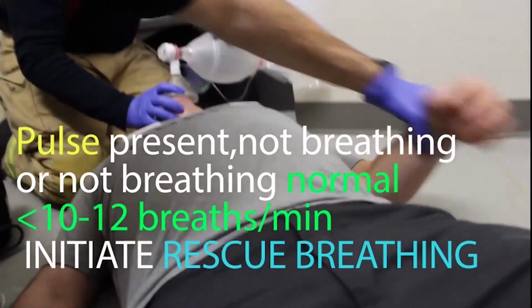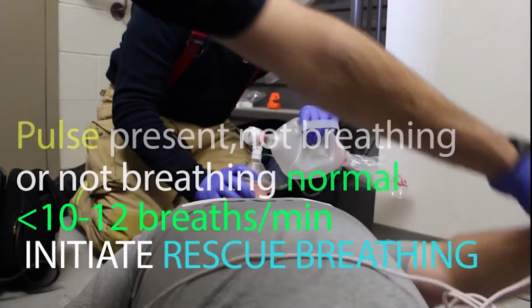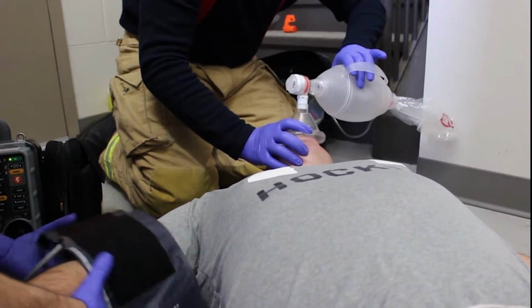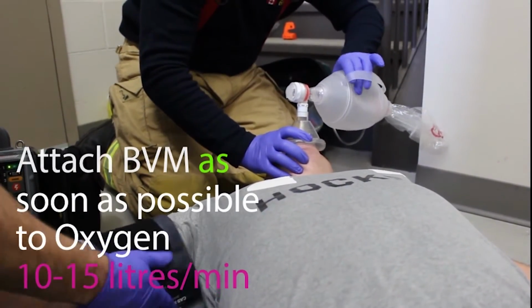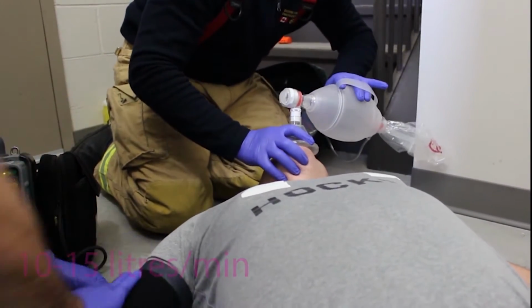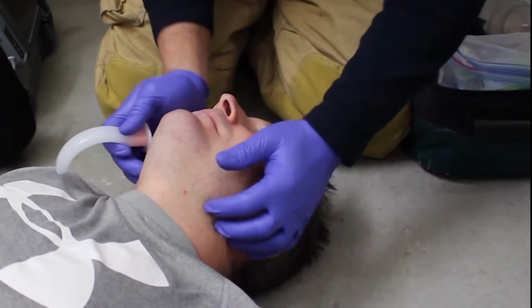If the pulse is present but not breathing, or not breathing normally, a rate under 10 to 12 breaths per minute, initiate rescue breathing with a bag valve mask, BVM, and 100% oxygen at 15 liters per minute. Give one breath every 5 seconds. Insert an oropharyngeal airway, OPA, when feasible.